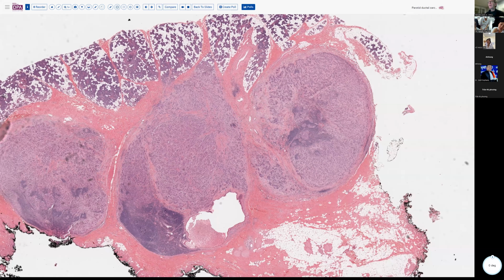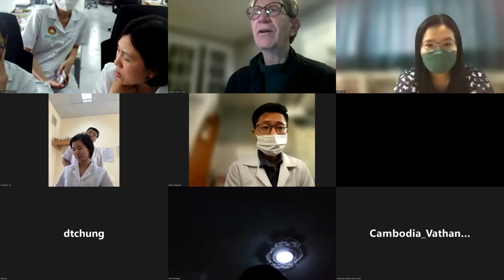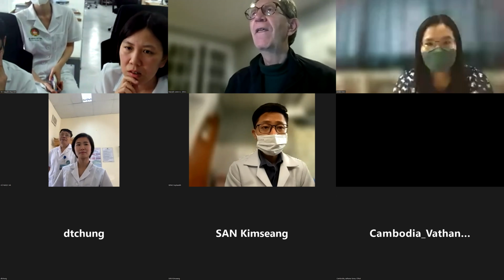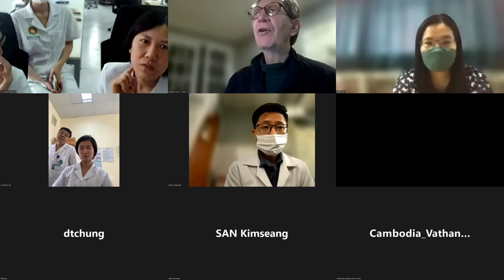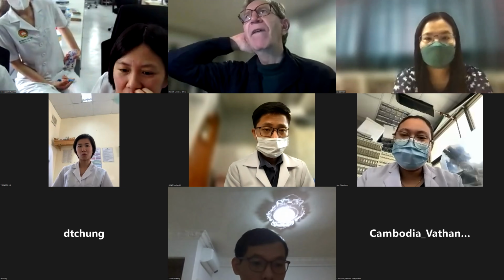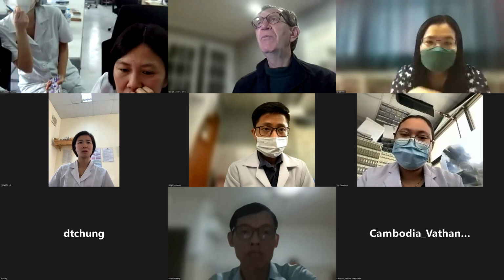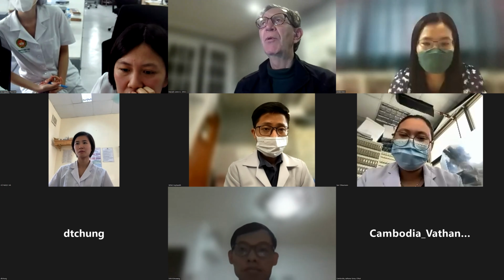Let's see, I've got a comment here, so I'm going to take a look at the question. So the question, a very good question, Dr. Lin: how to distinguish epithelial or myoepithelial carcinoma from mucoepidermoid carcinoma when the mucoepidermoid component has no obvious squamous component.